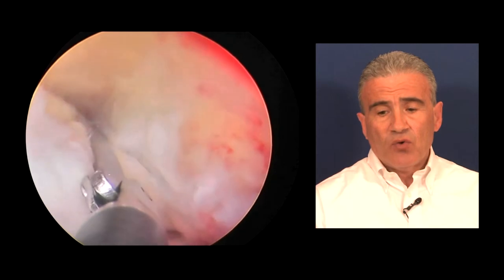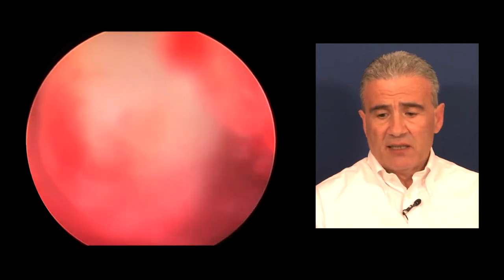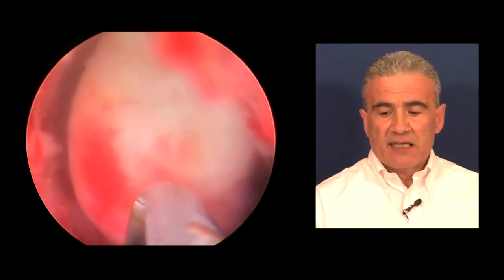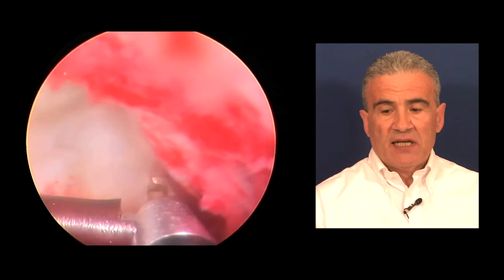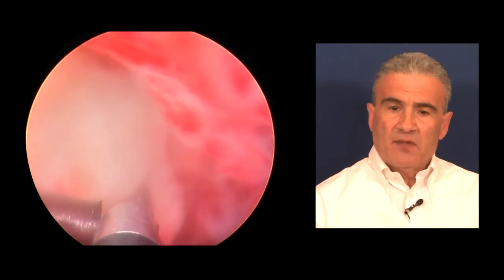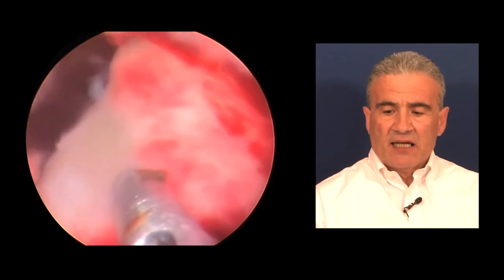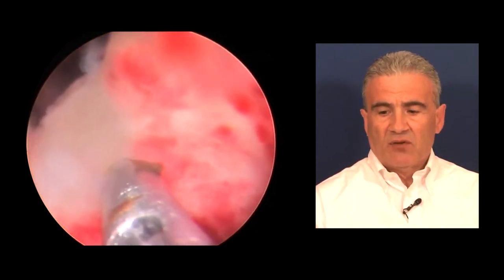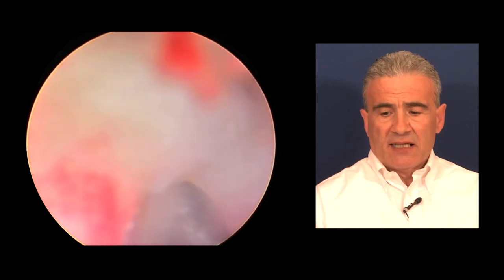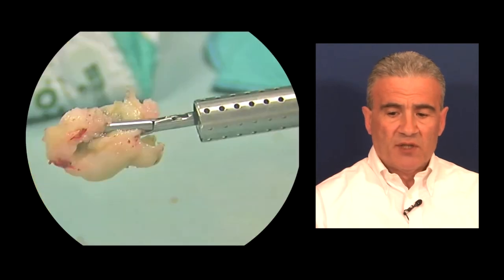It was not necessary to use electricity, so it was not traumatic for the patient. At this point the traumatic forceps are inserted. There is an attempt to firmly grab the myoma through rotation, detach the fine tissues which are keeping it bound to the pseudo-capsule, and extract it progressively through the cervical channel. In this image we can see that the myoma has been extracted completely.